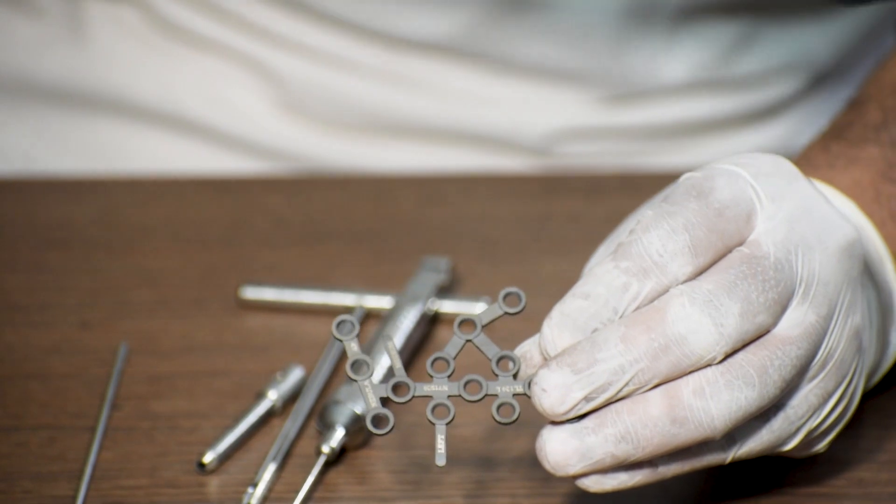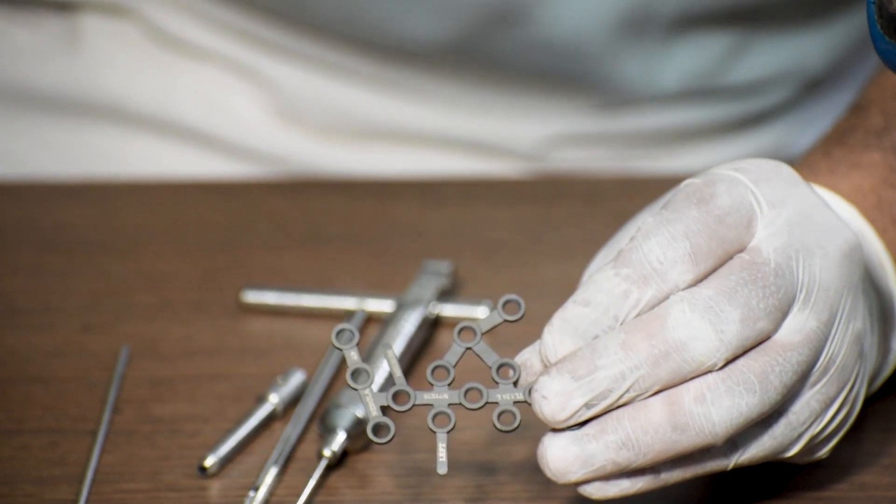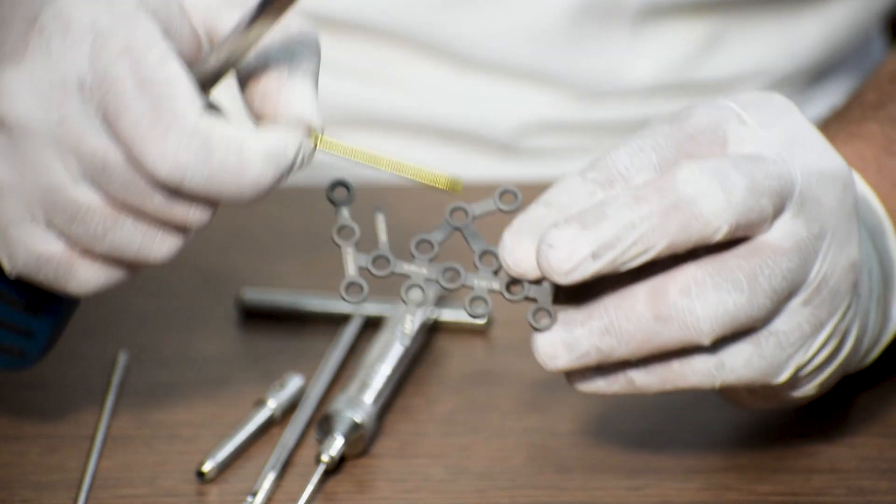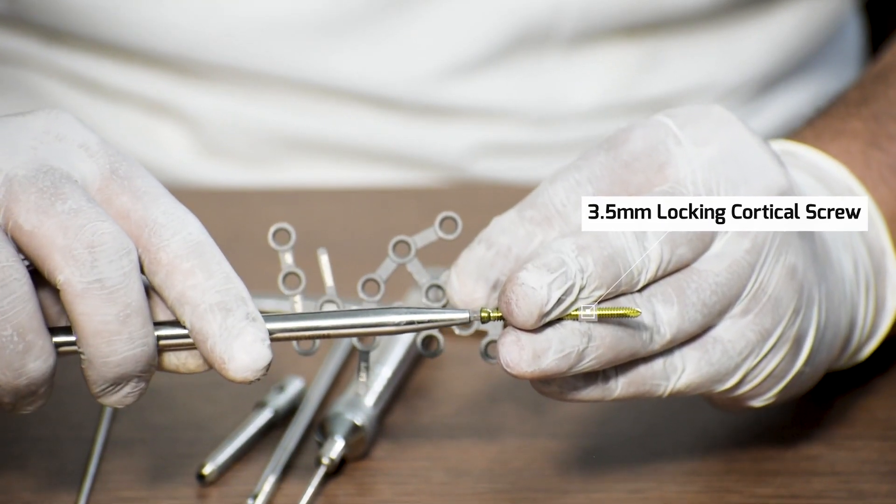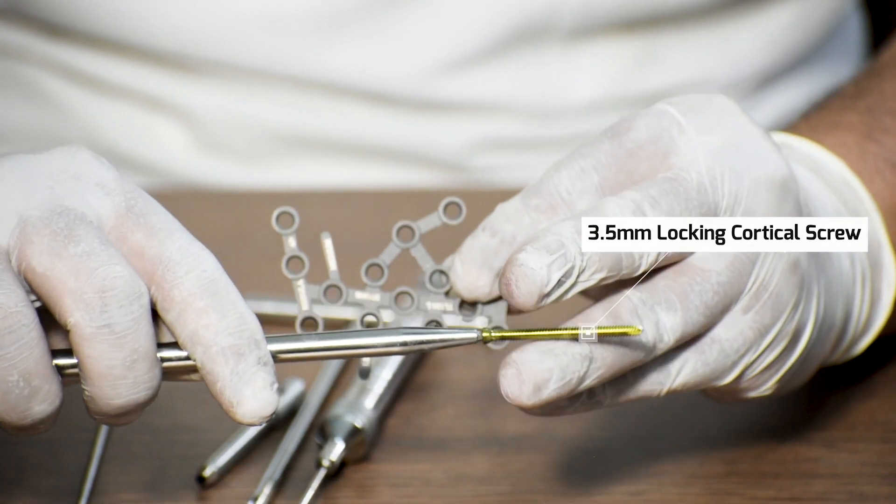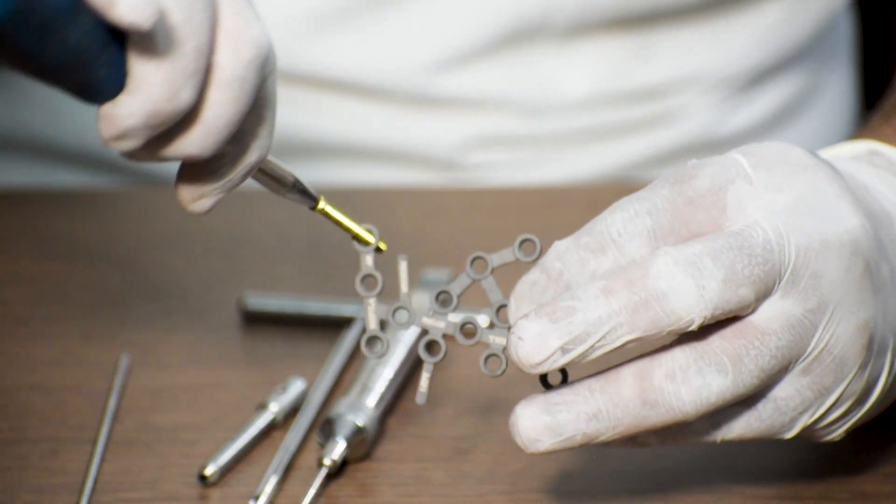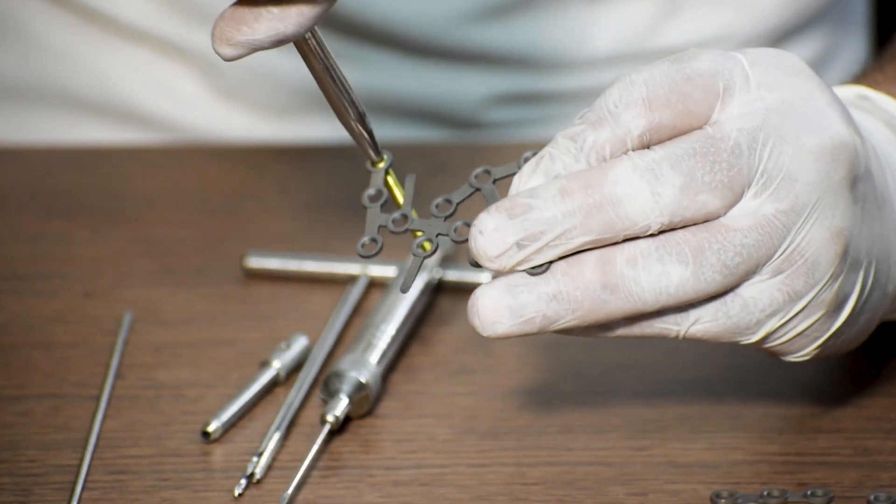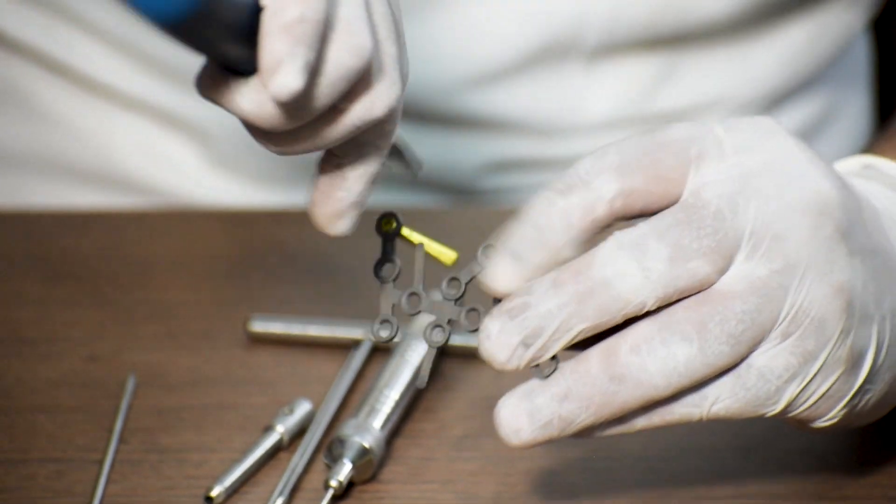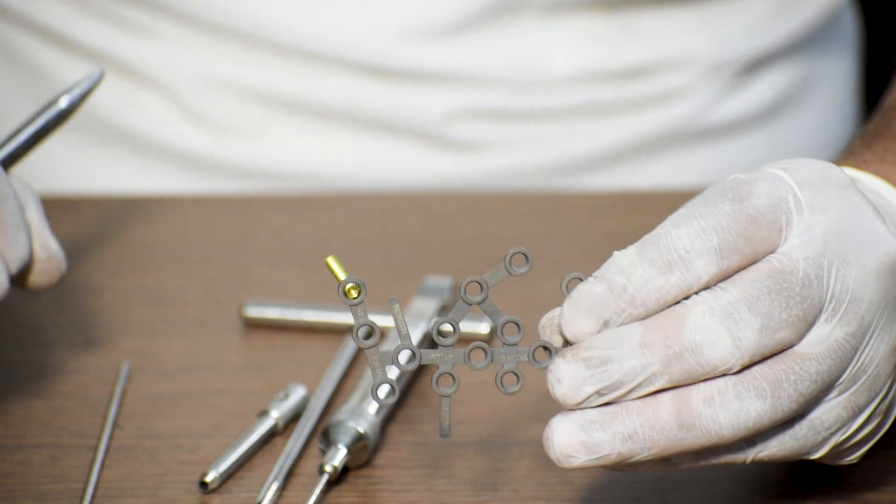After measuring the length of the screw which will be fixed in this plate, we will take a 3.5 mm locking cortical screw and with the help of a 3.5 mm solid screwdriver, we will fix this screw on the desired hole of this plate in the fracture site.